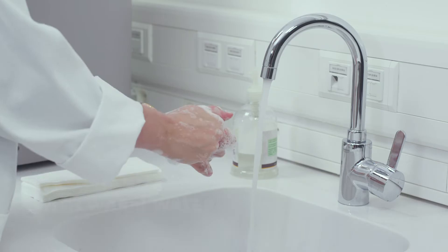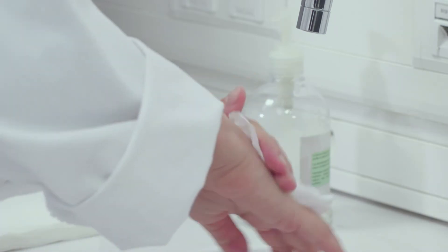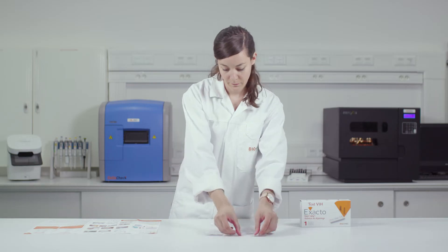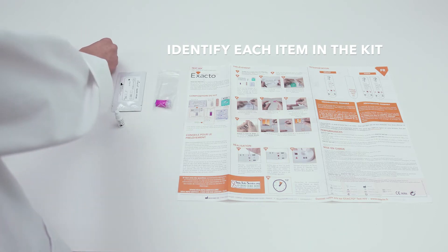Before taking the sample, it is important to wash your hands with warm water in order to stimulate the blood circulation. Make sure each item is included in the kit and identify them while placing them on a flat and clean surface.